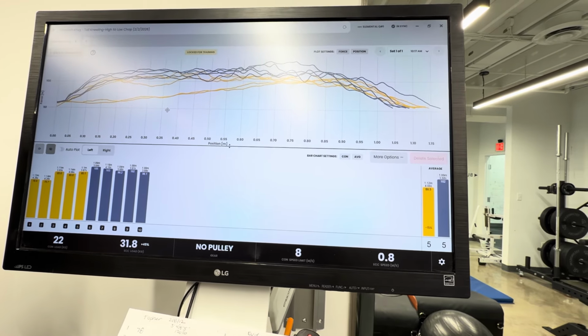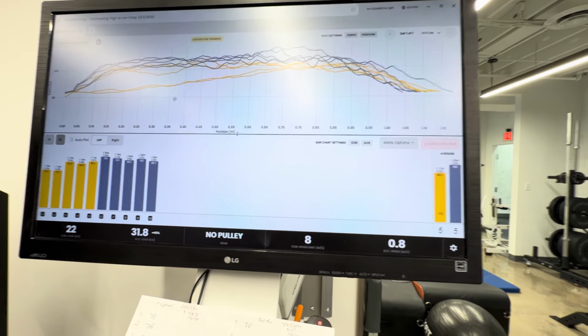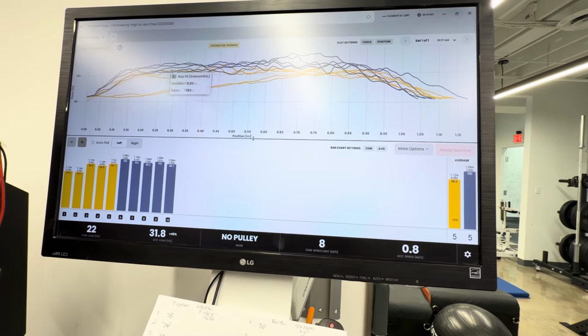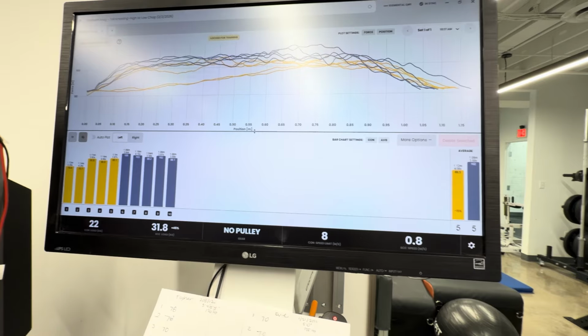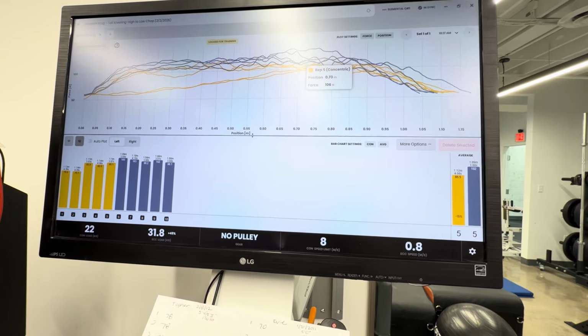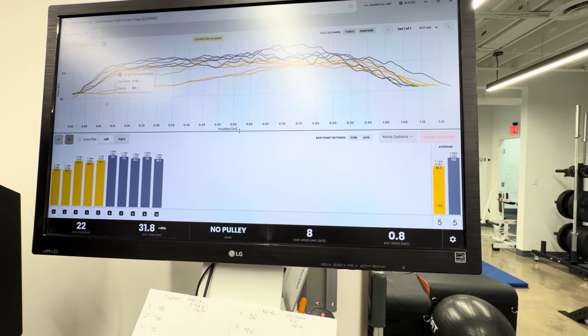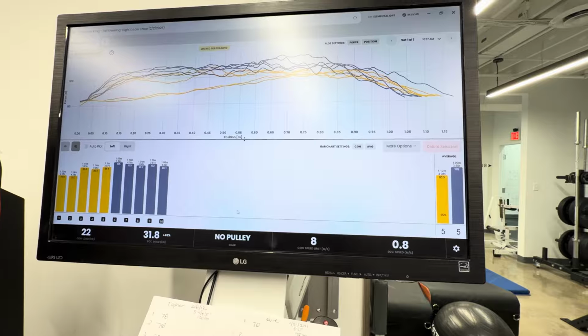It tells us we need to build up their endurance within their training. And also it tells me a lot about their neurological input. If it's really jaggedy, up and down, up and down, there's some sort of neurological input that is preventing them from getting a nice line. So in general, that's how we're going to edit the graphs once they are done.